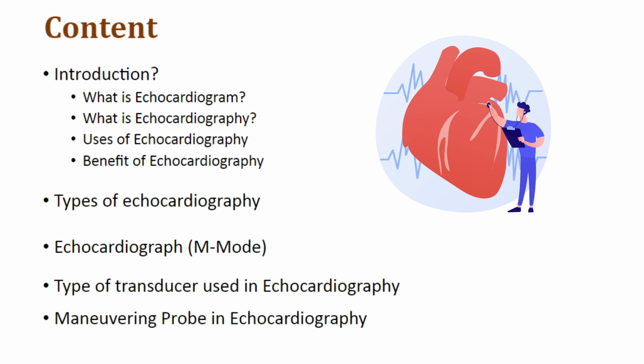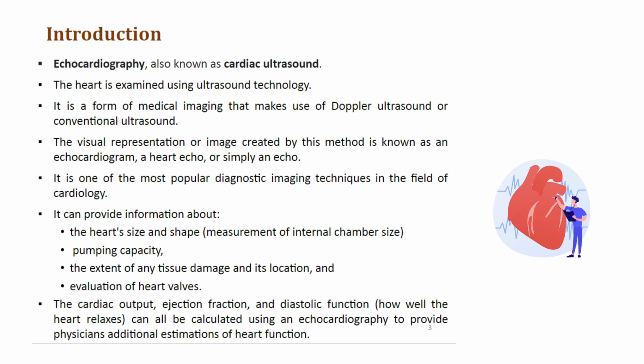Now, we are going to see what is echocardiogram and echocardiography. Echocardiography is also known as cardiac ultrasound. In echocardiography, heart is examined using ultrasound technology. Echocardiography is a form of medical imaging that makes use of Doppler ultrasound or conventional ultrasound for cardiac disease detection.